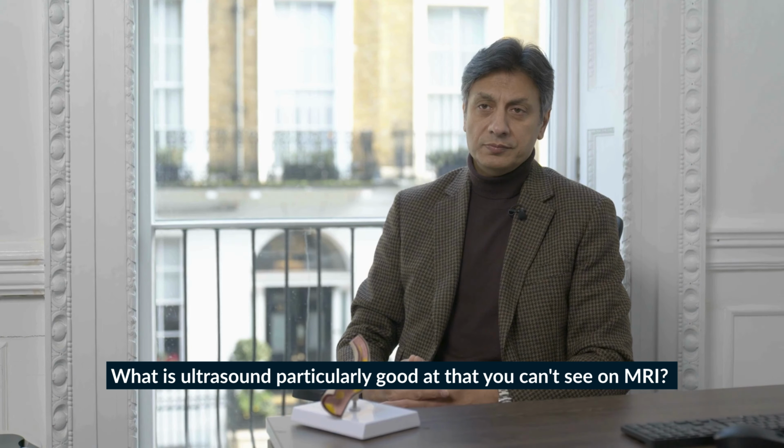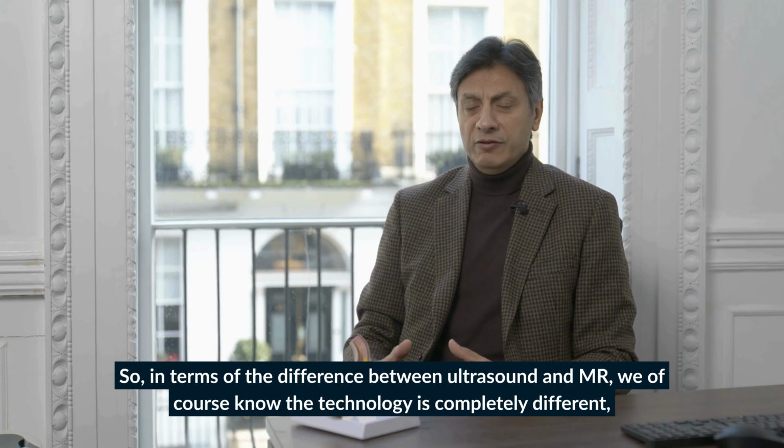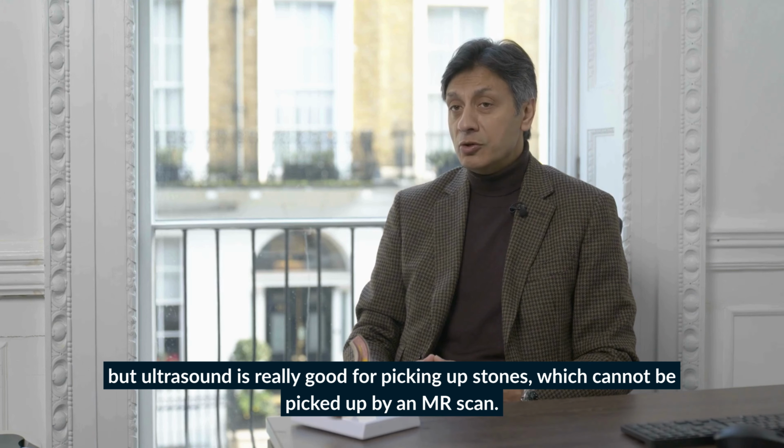What is ultrasound particularly good at that you can see that MRI can't? So in terms of the difference between ultrasound and MR, we of course know the technology is completely different, but ultrasound is really good for picking up stones which cannot be picked up by MR scan.